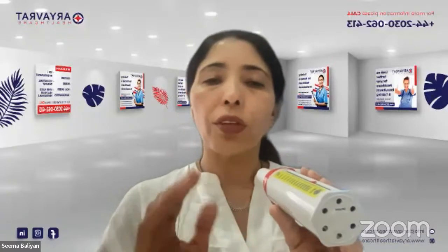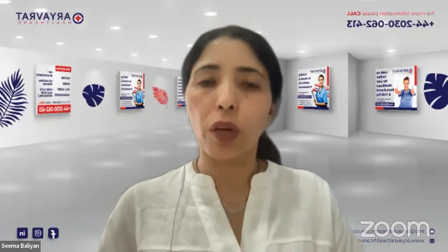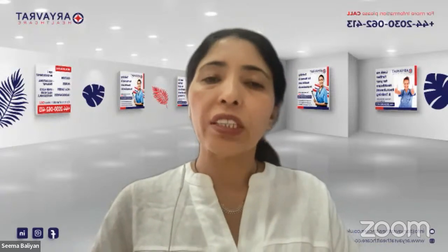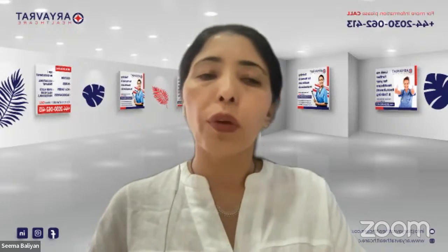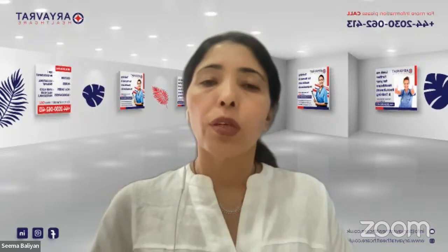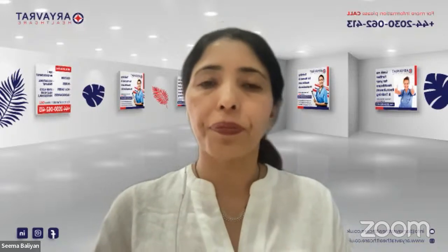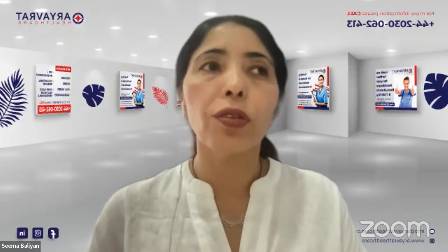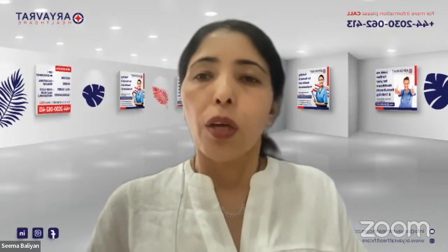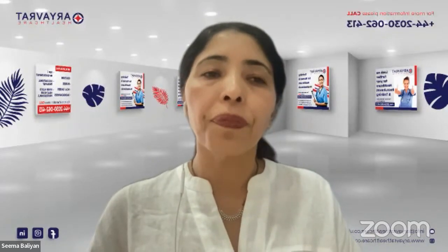So I know that of my 3 readings, the lowest is 370 and the highest is 400, and the difference is not more than 40. So out of these 3 readings, I am going to take the highest reading as my final reading. So 400 out of these 3 is going to be my final lung capacity. Have all of you understood that? Yes, ma'am.